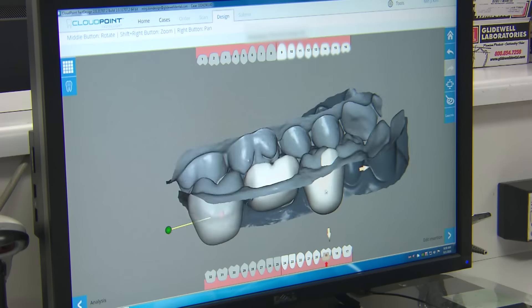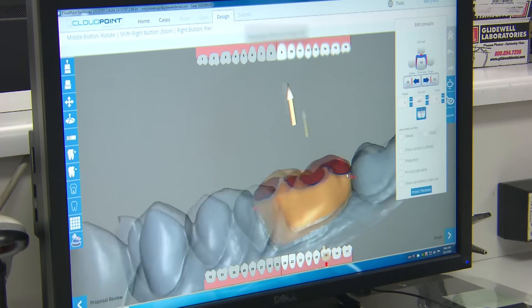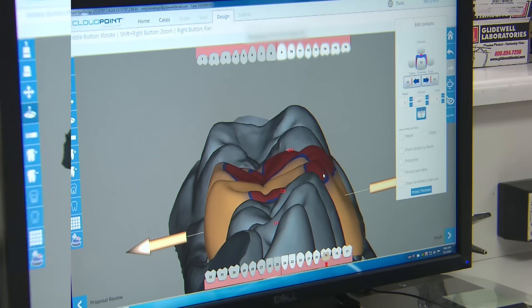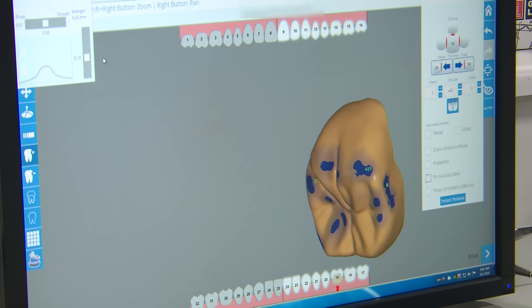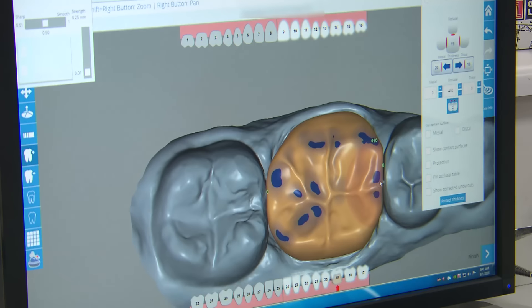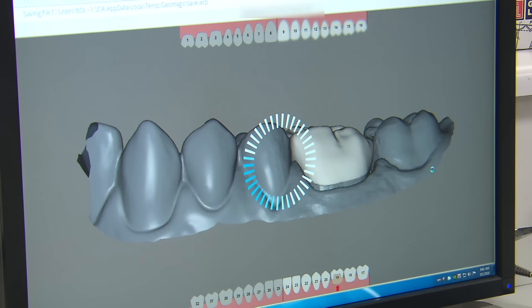The software then establishes the heaviness of the contacts and we can see exactly what level we need to raise or reduce those areas, also adjusting the proximal contacts to ensure that it will fit properly within the patient's mouth. Any specific adjustments are also achieved where we can move certain areas to increase contours, reduce spots, change the marginal ridge position, and really just ensuring that the final result meets the form, function, and aesthetic needs for this patient.